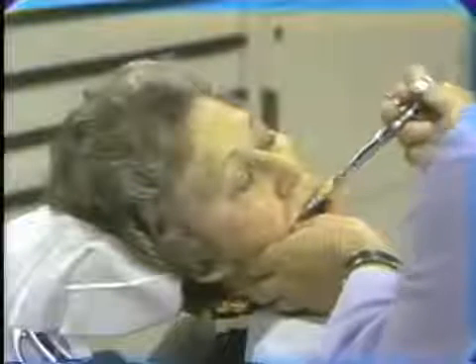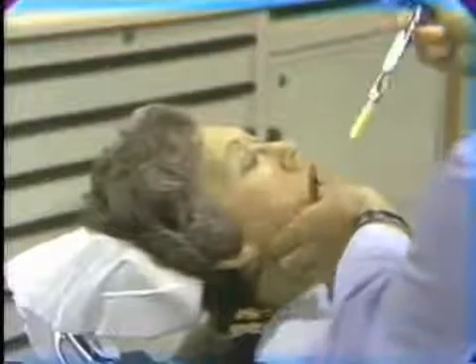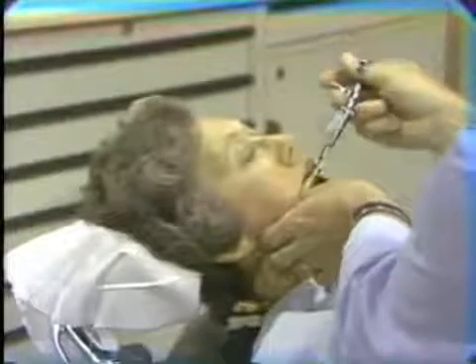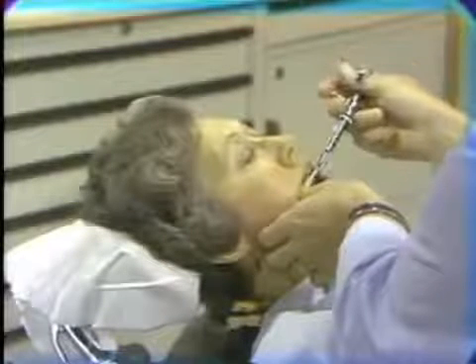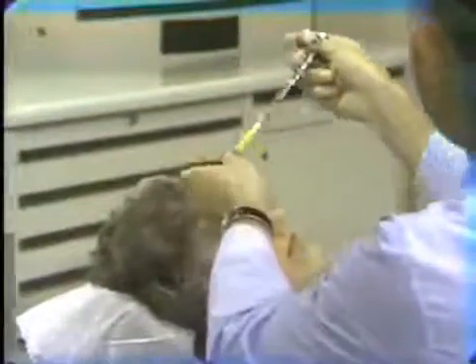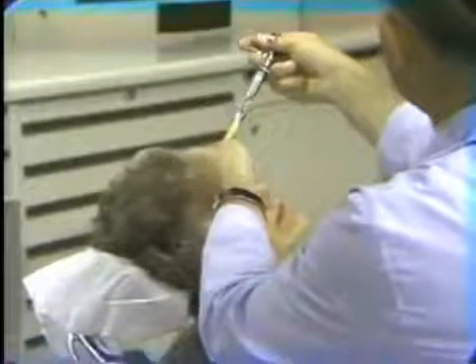A problem may develop giving the anesthesia for mandibular arch if the patient is in the wrong position. If she has her head too high, you can see that it's very difficult to come down. You don't have visibility into that quadrant. It's awkward. Also, if the patient is too tall and you have your hands and elbows high and you're trying to come down in this angle, it's nearly impossible to gain adequate anesthesia.